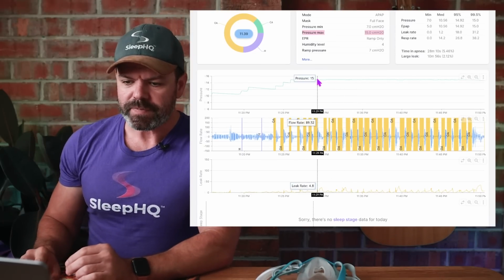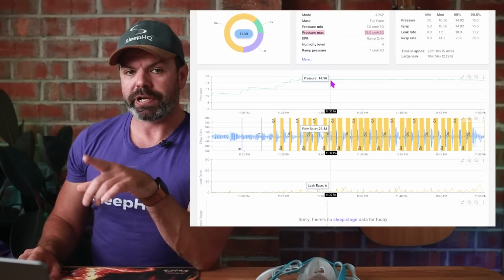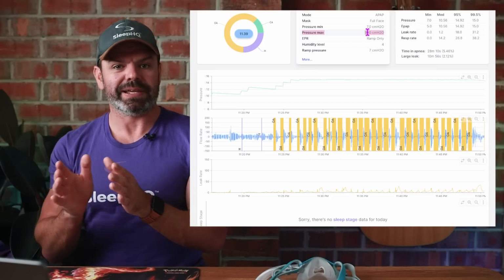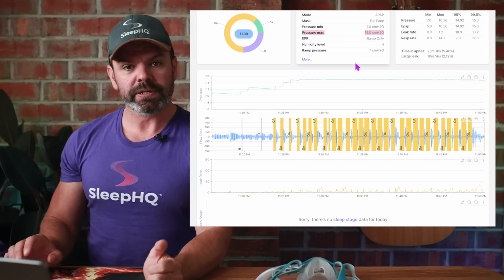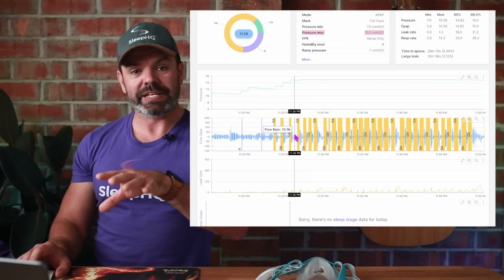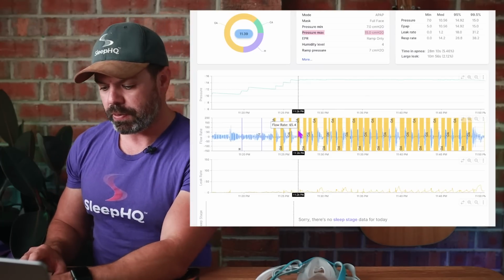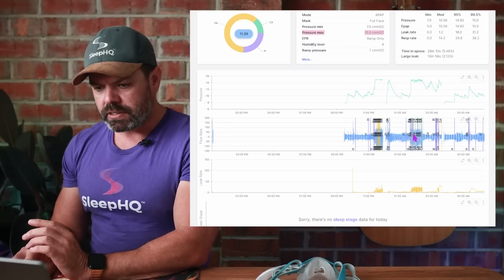So although Adrian's pressure probably does need to be higher, before he changes that and increases that pressure max level from 15 to 16, 17, 18, whatever he needs, he could also try just positional changes, making sure he stays off his back. He could get a SleepHQ O2 Ring and set up an alarm so that when he has these OA flags and his oxygen levels drop, the ring vibrates and tells him that he needs to roll onto his side. That's a really cool little thing you can do with the SleepHQ O2 Ring. Anyway, I'm getting off track like I always do. So let's move forward in the night to this section here.